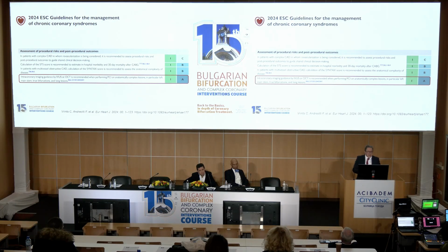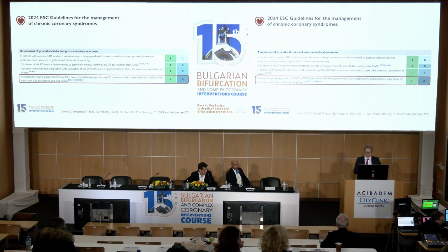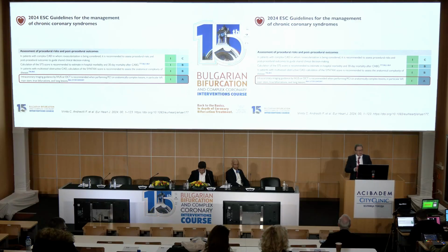the procedure. And I would like to finish my presentation, reminding you that since 2024, the indication for IVUS and OCT, especially for anatomically complex lesions, particularly for left main stenosis, true bifurcations, long lesions, is recommended as a 1A.